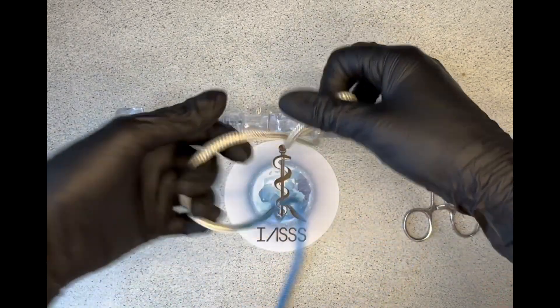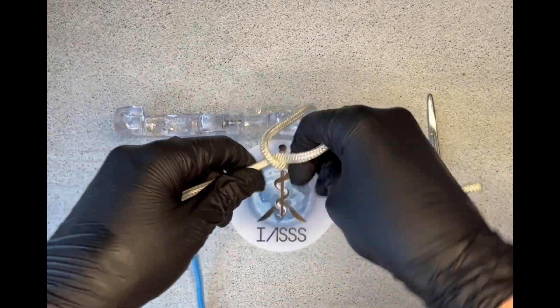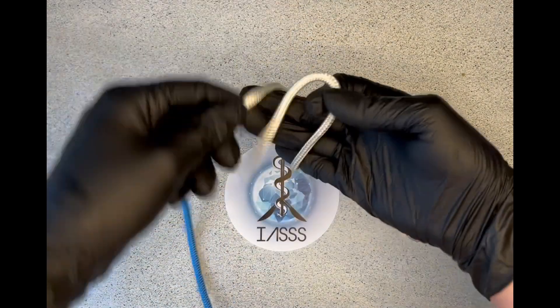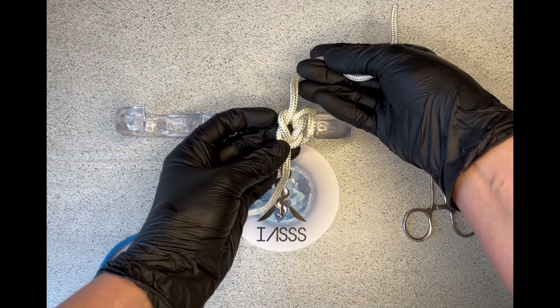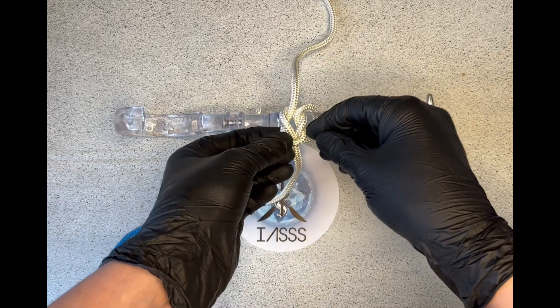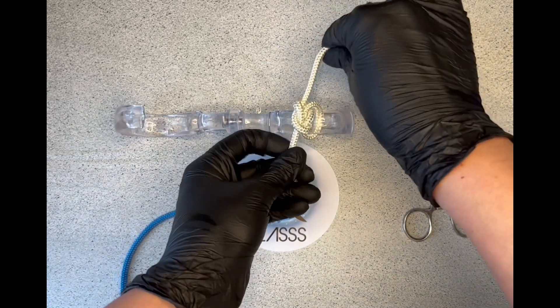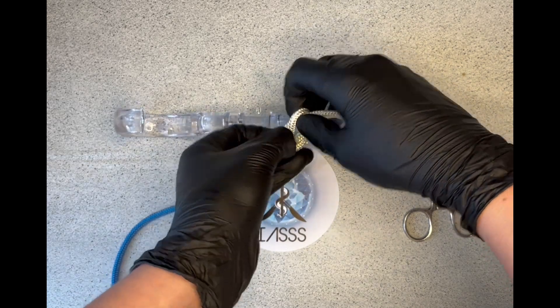A slip knot is not stable. If you're not watching what your hands are doing and you accidentally do two throws the same way rather than pulling away from yourself alternately, you'll create a slip knot — and a slip knot is not a tight knot. It's not one that will be stable within the tissue; it will come loose.